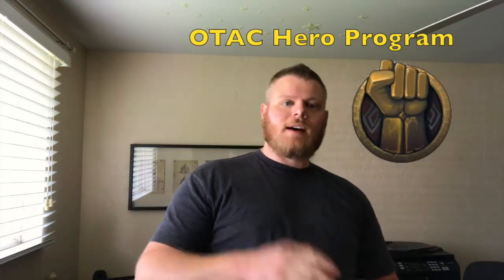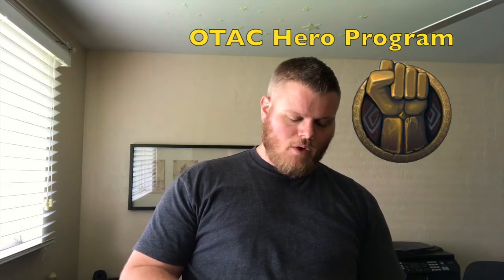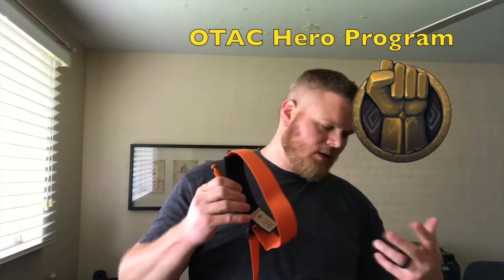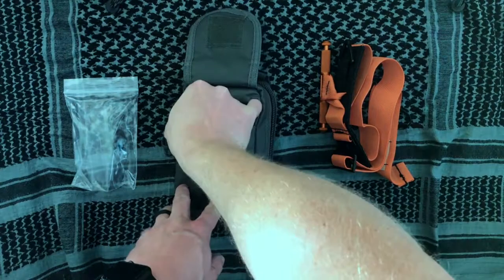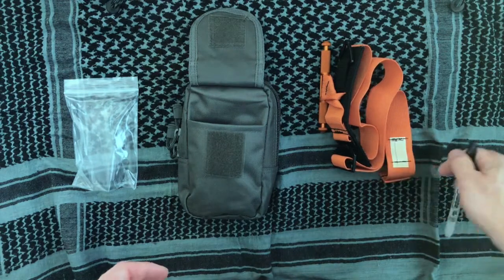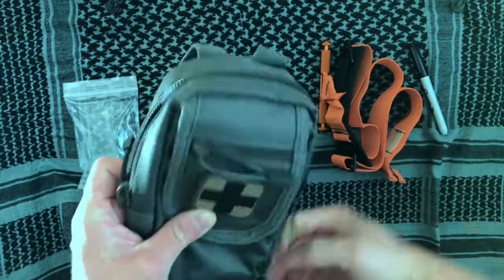Additionally, OSIGS has a program called the Heroes Program: if you were to utilize a tourniquet in a life-saving situation, you can read the details on their website and they will actually replace the tourniquet for you. Just a cool feature. They've also packed in a Sharpie, obviously for noting the time. So that's the front pocket — pretty basic design, but really efficient.